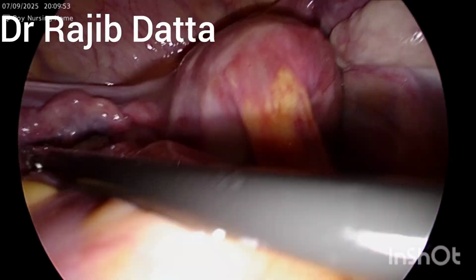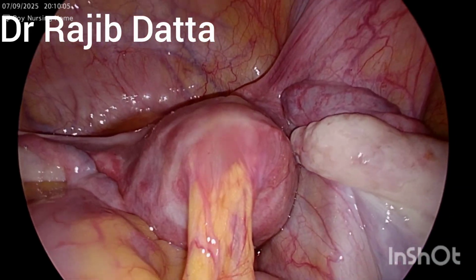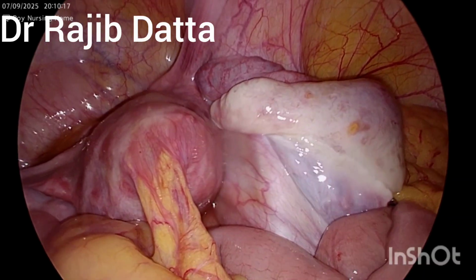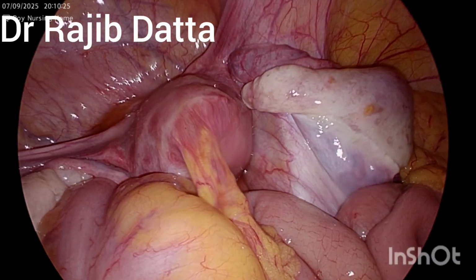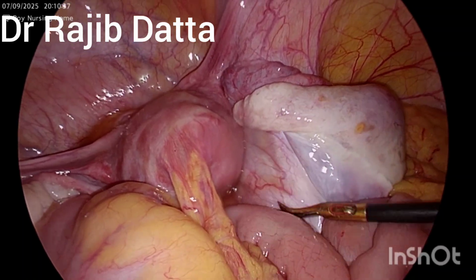On the left side also there is an engorged fallopian tube. The ovary is also very much dilated, and this fundal adhesion of the omentum has to be taken care of because it is the cause of the pain for this patient, and there are adenomyomatic changes of the uterus.